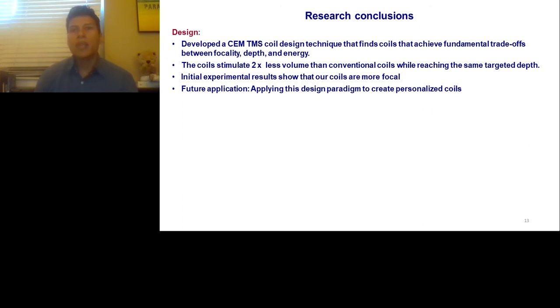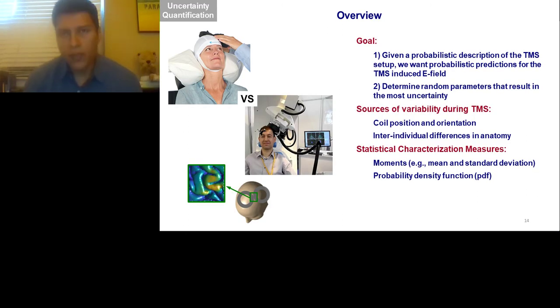Eventually, this technique could be applied to develop personalized coils that exploit the local gyral and sulcal geometry of the cortex to deliver more focal and more targeted stimulation. So this concludes the design part of our talk.